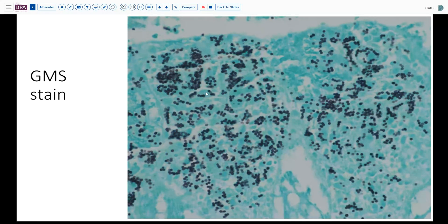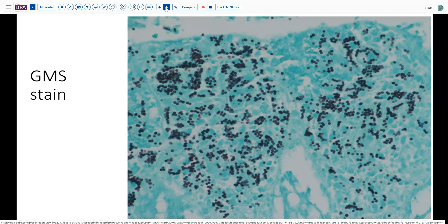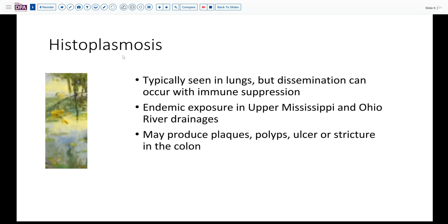Here's our GMS stain. As you can see at high magnification, this is staining very nicely with yeast forms intracellularly within the macrophages, and that confirms our impression of histoplasmosis. Other stains were negative in this individual. Histoplasmosis is not a common entity in the GI tract — usually we see it in the lungs — but if there is immunosuppression such as in HIV or AIDS, dissemination can occur. This would qualify as one of the disseminated infections that would move a patient from just being HIV-positive to having AIDS.